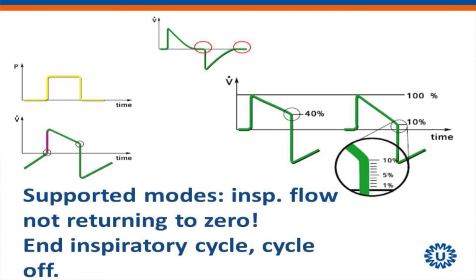What are you doing? What kind of cycle off time do you use? 10 to 15.